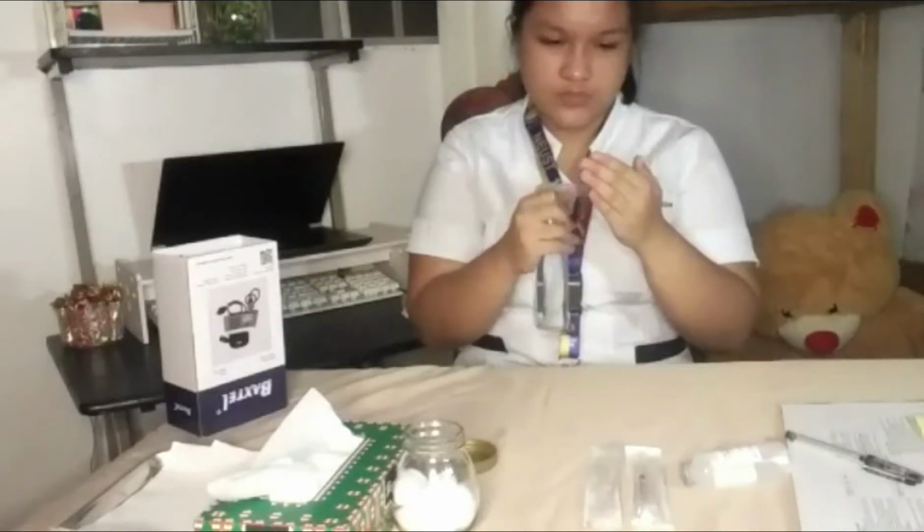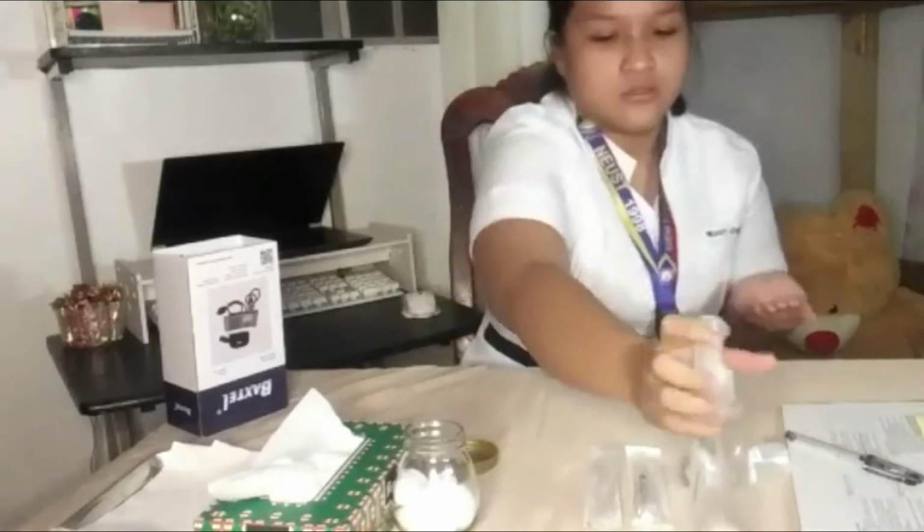And now for our intramuscular medication. First, I am going to start with my hand hygiene. I'm going to spray an antiseptic alcohol.